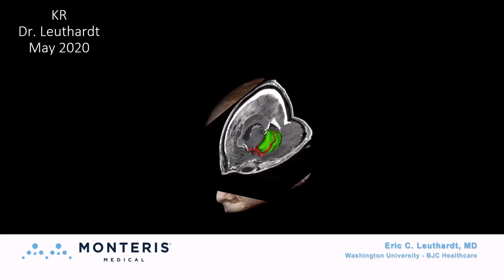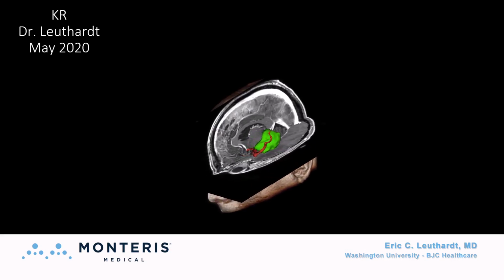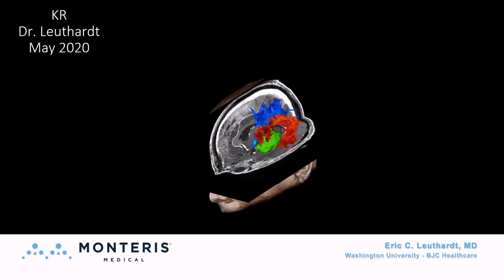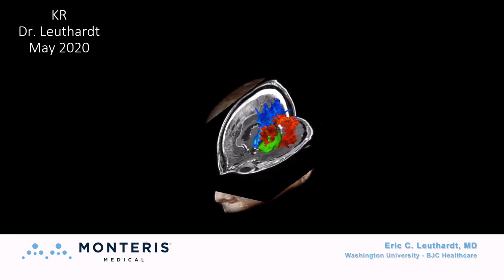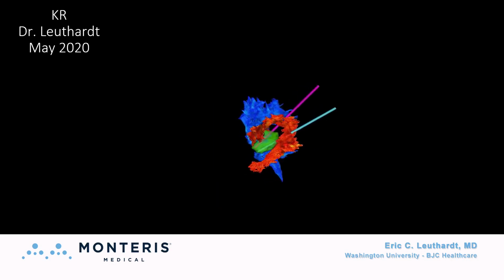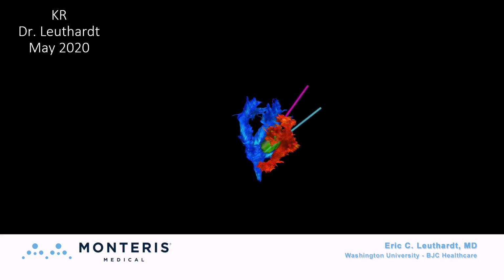And the tumor you can see in green, you can see it relative to the middle cerebral artery branch. You can see that, with the angle of the insula, it's kind of facing downward. There you see the corticospinal tract and the arcuate fasciculus in blue and red, respectively. And so to handle this volume, we had 2 probes going from the parietal lobe, going down the barrel of that tumor. And we were able to treat, I'd say, around 95% of that volume.